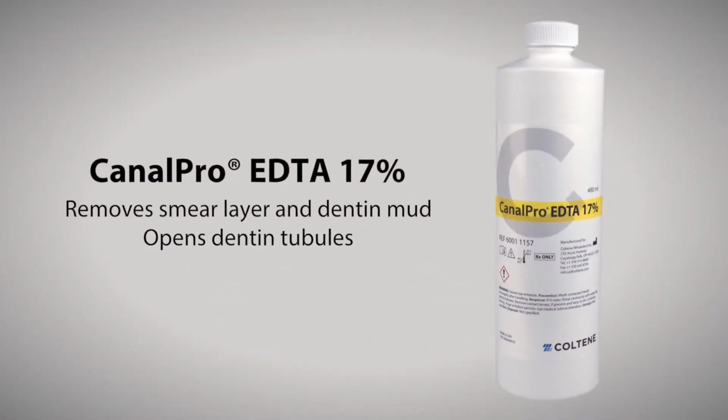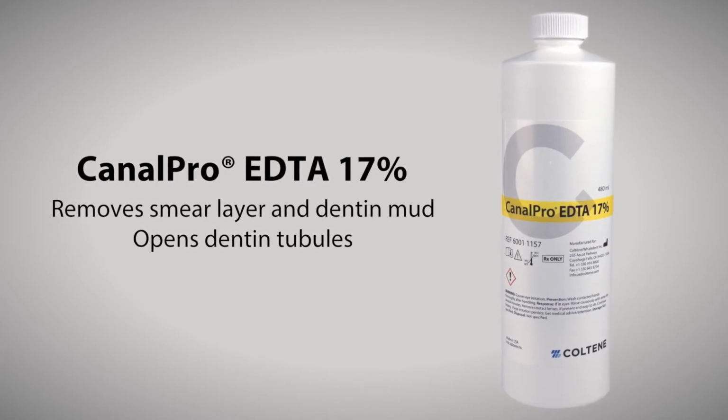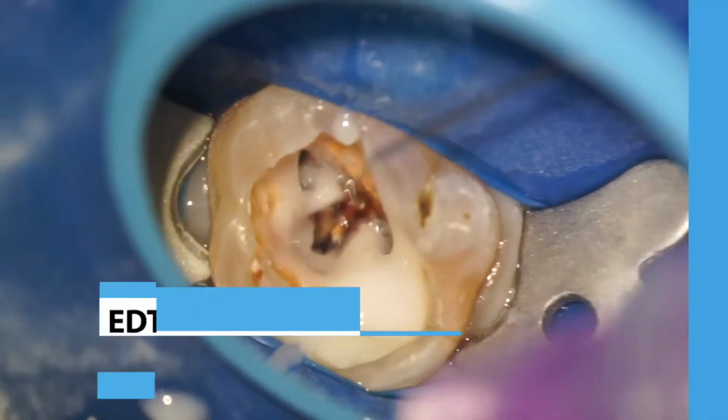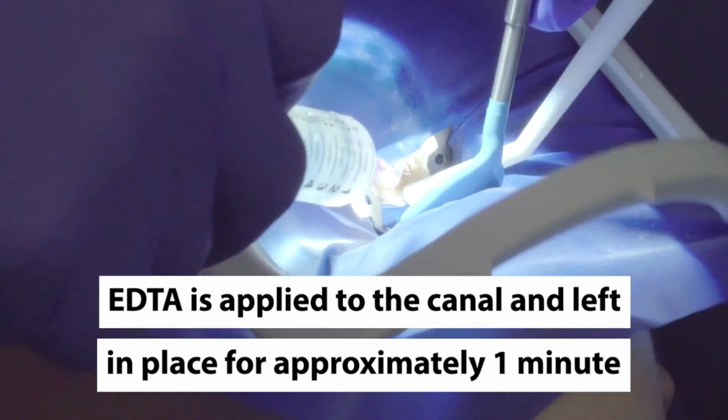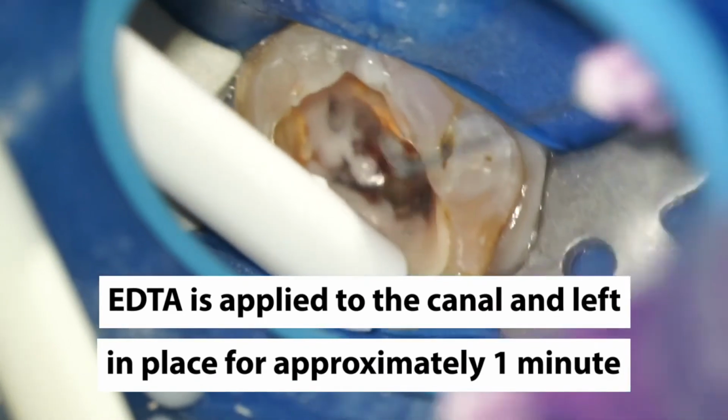One of the best ways to remove the smear layer from the canal walls is using a solution called EDTA. The EDTA is applied to the canal and left in place for approximately 1 minute and helps in removal of the smear layer.